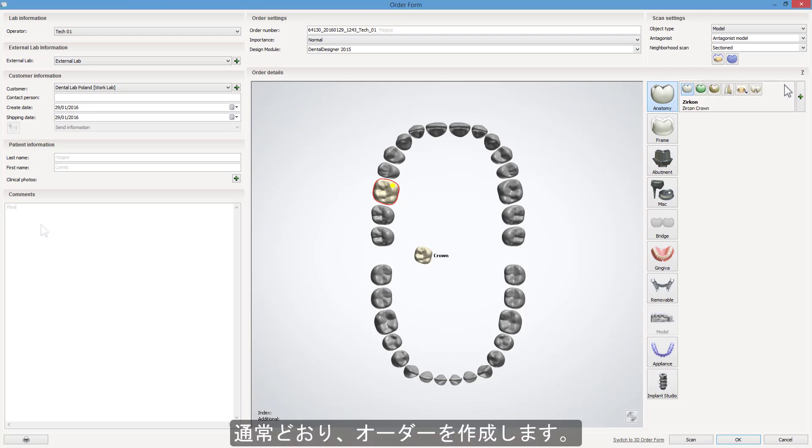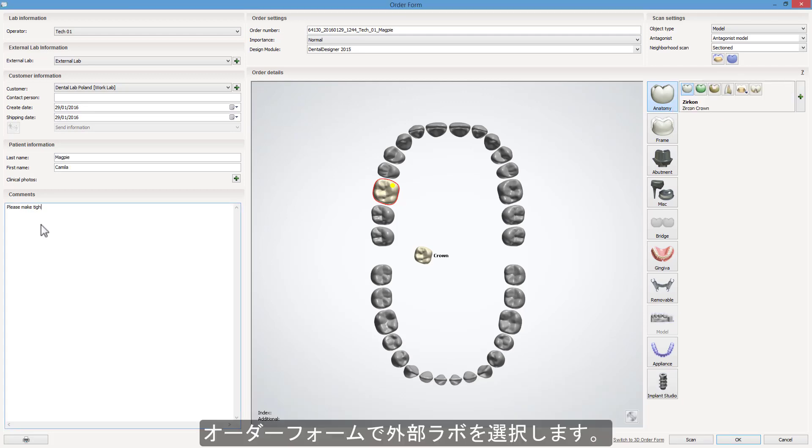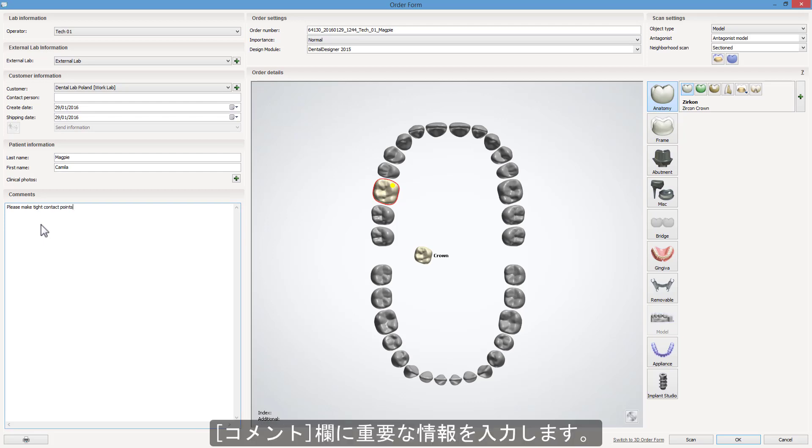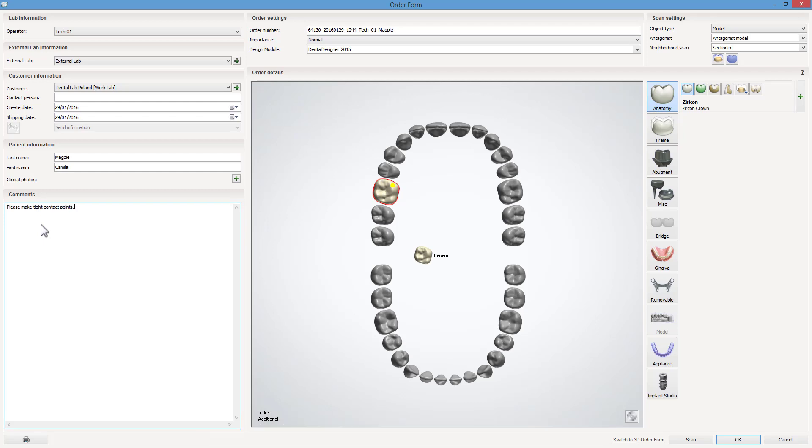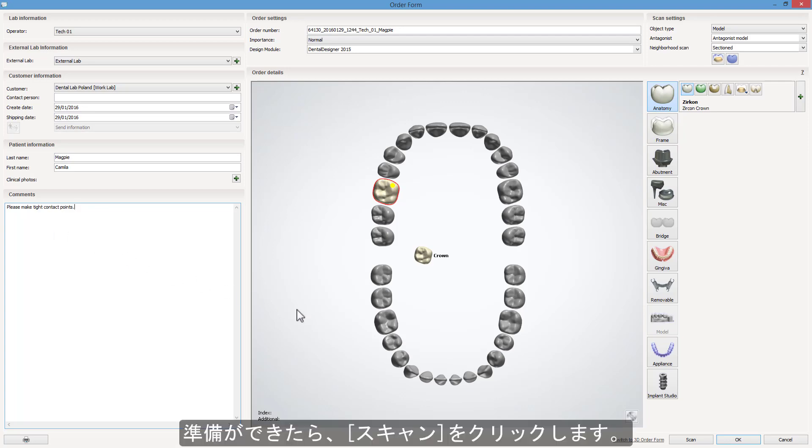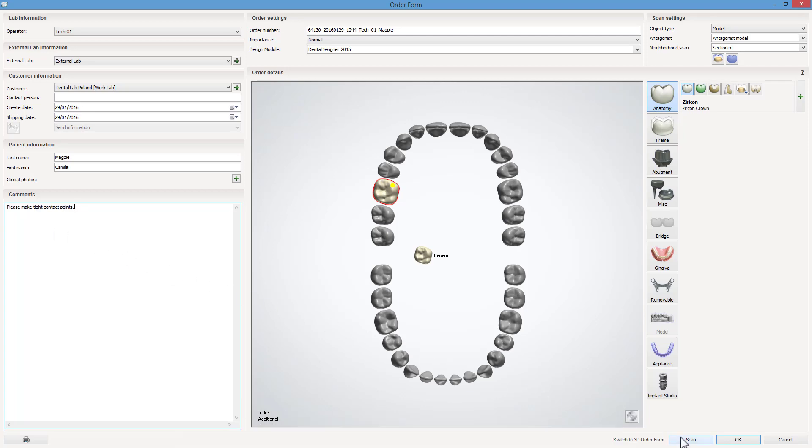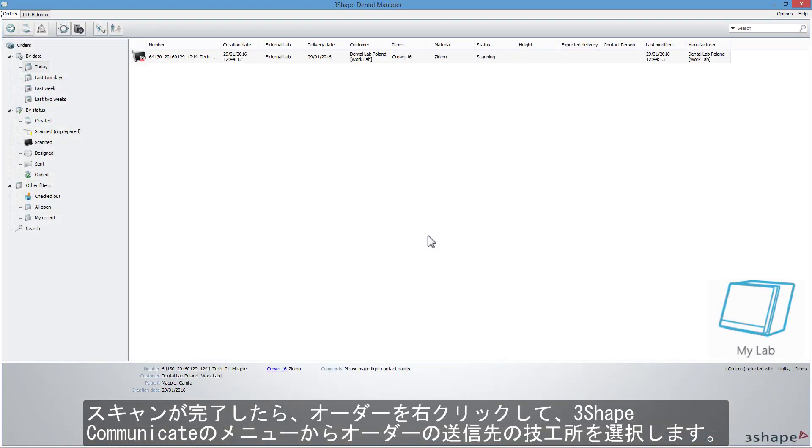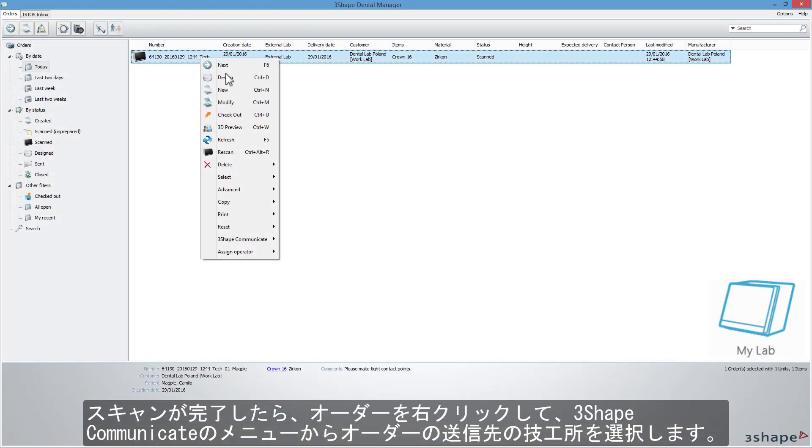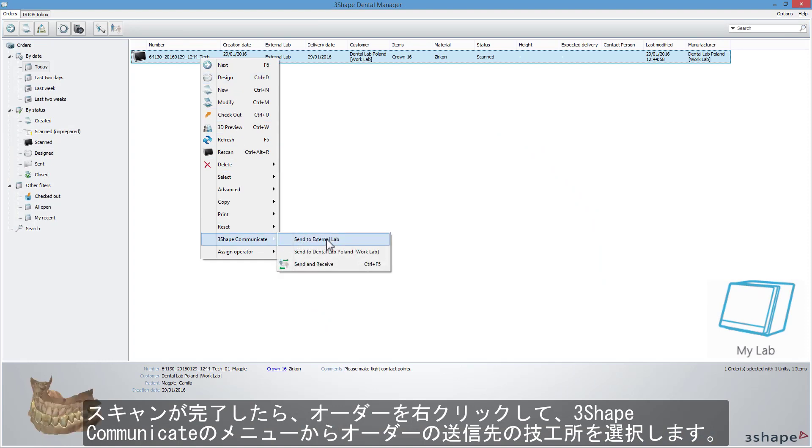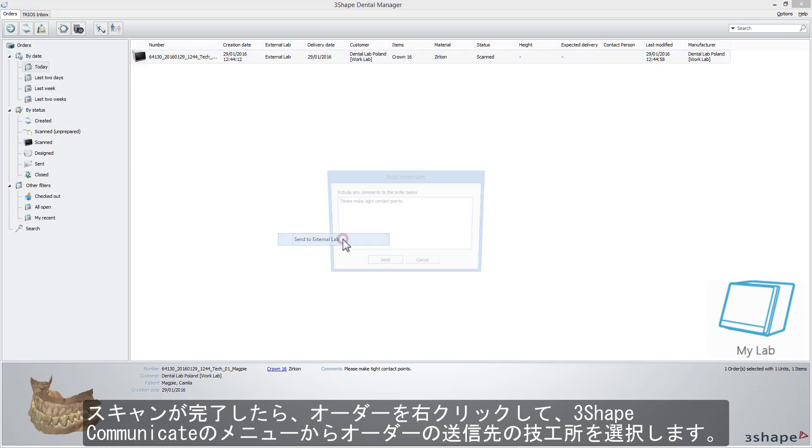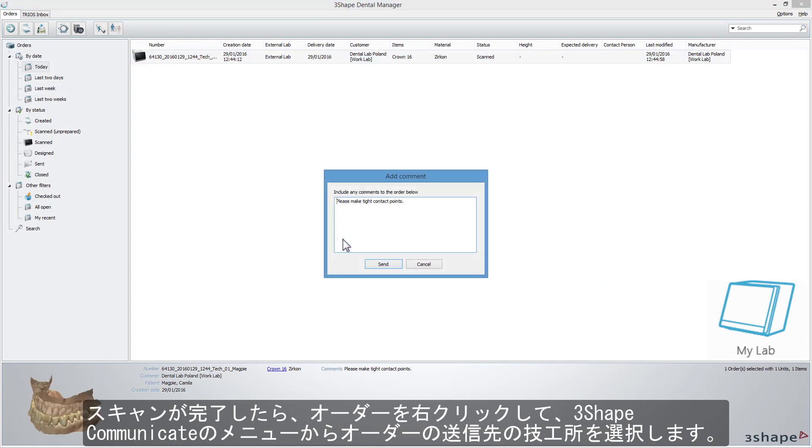Create an order as usual. Choose an external lab in the order form. Add any important information in the Comments field. When ready, click Scan. After the scanning process is completed, right-click on the order and from the 3Shape Communicate menu, choose a lab to whom you want to send the order.